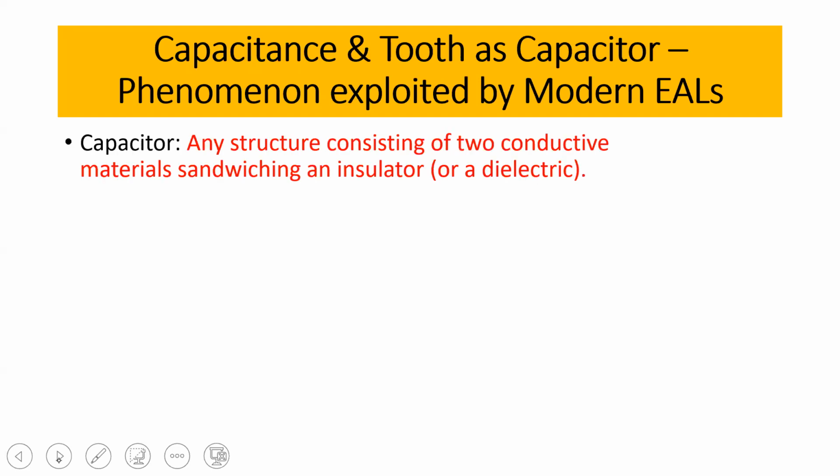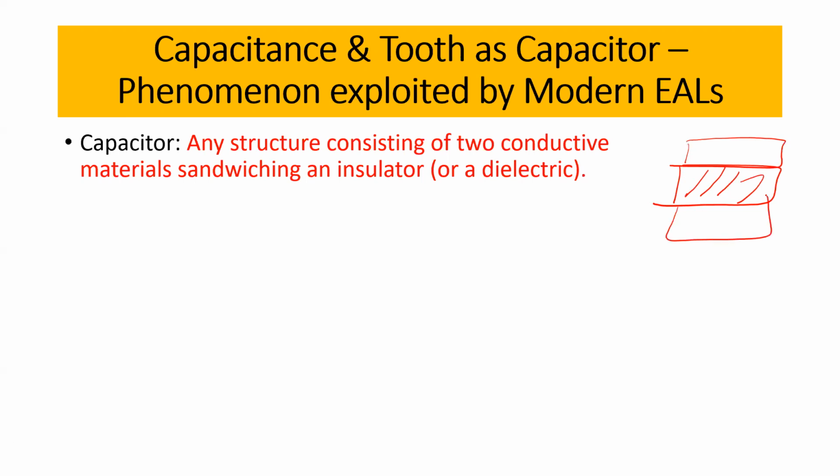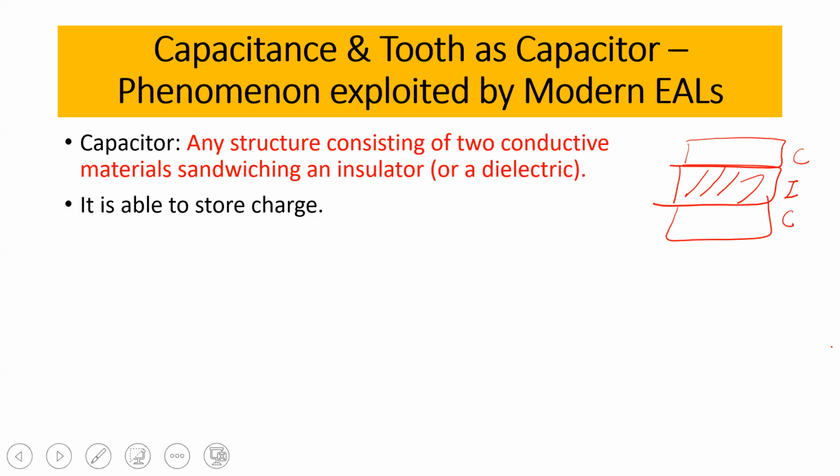But first, a capacitor is any structure consisting of an insulator that is sandwiched between two conductive materials. And this capacitor has the ability to store charge.